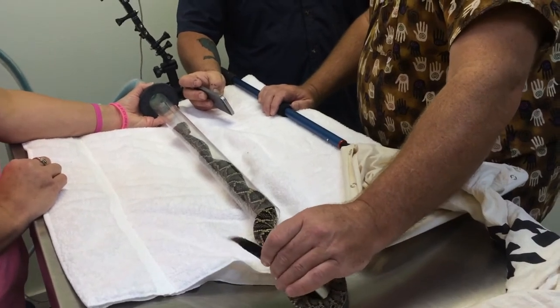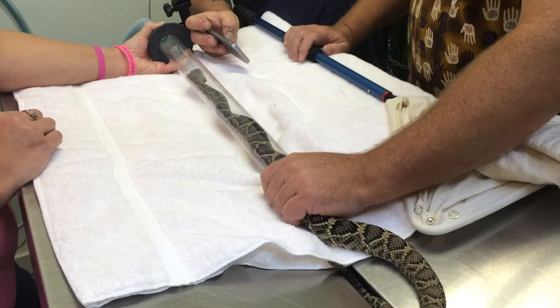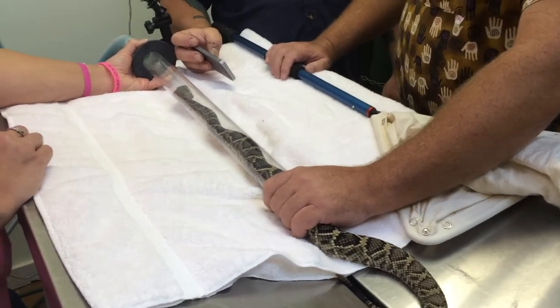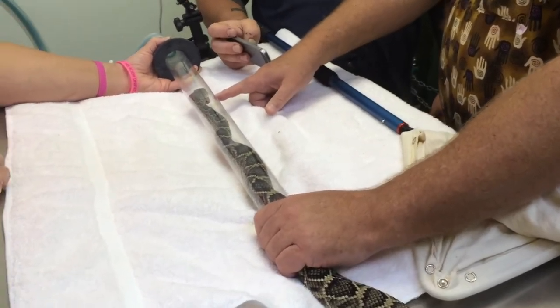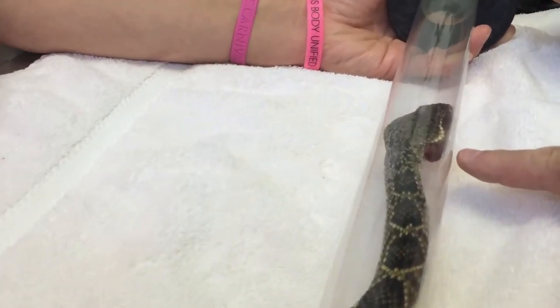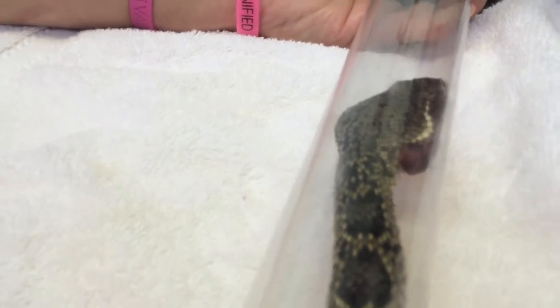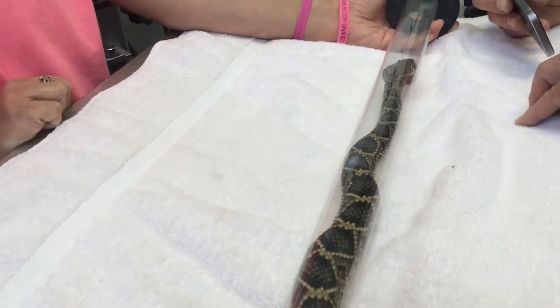This is Rodney the Rattler. All right, so everyone watching, this guy was hit by a car, was brought in by one of the wildlife officers yesterday. They saw it probably clip his head. He doesn't think it got him fully, but he was able to have a wildlife bucket on board, and you can actually see the raw flesh sitting right there. So we're going to take some x-rays and see if his jaw's broken or if that's just a piece of pinched flesh, and we will take that next step in a minute.